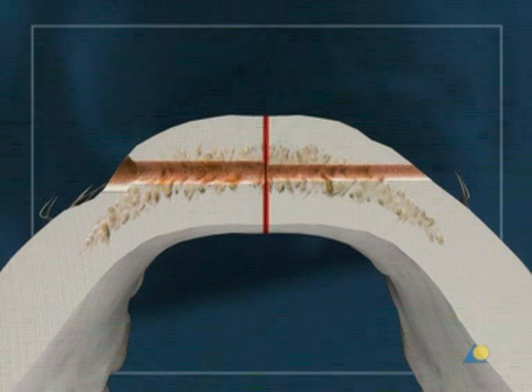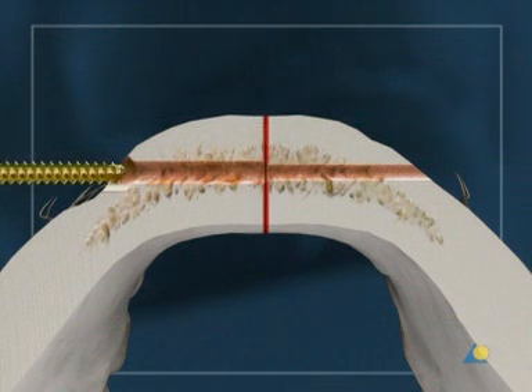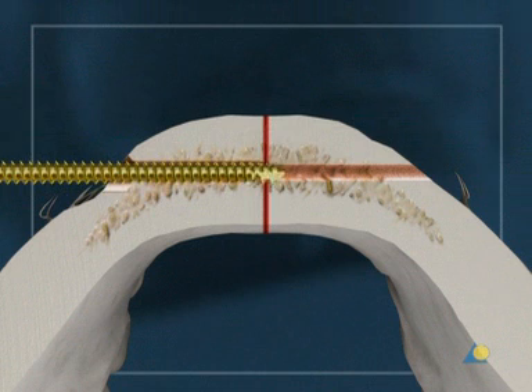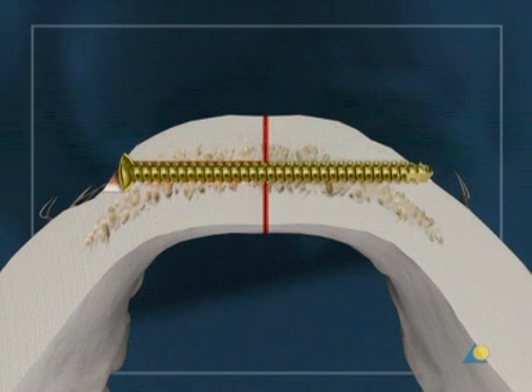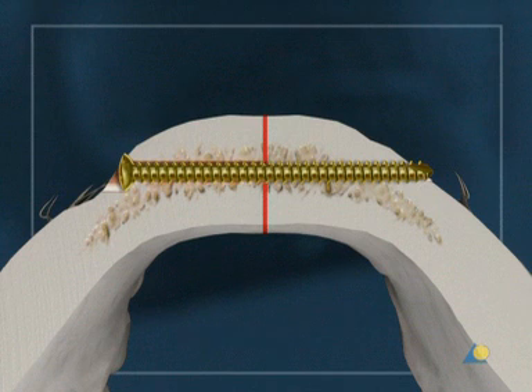Counter-sinking allows the maximum contact between the screw head and the underlying bone to optimize compression. As soon as the screw head touches the bone, further tightening of the screw will lead to interfragmentary compression. This process is called the lag screw technique.